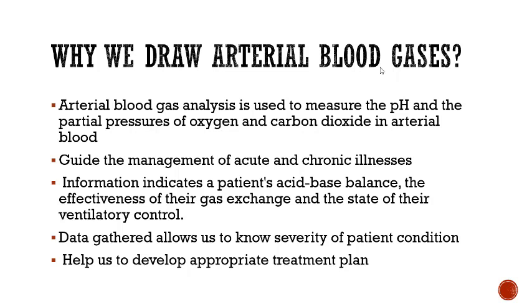And what we're looking at in order is pH, PaCO2, which is the pressure of CO2 in your arterial blood, PaO2, which is the pressure of oxygen in your arterial blood, and then we're looking at something called bicarbonate.